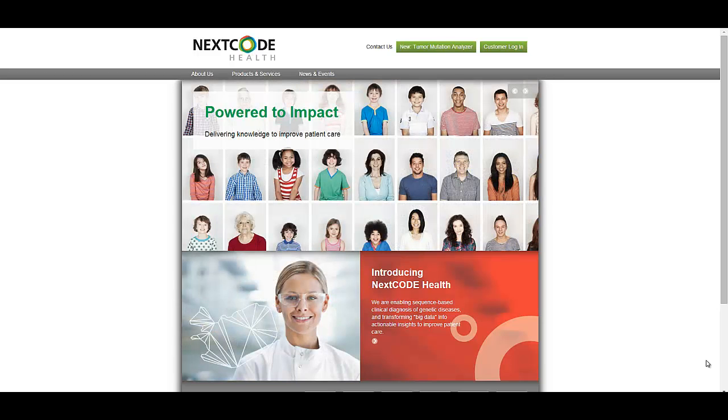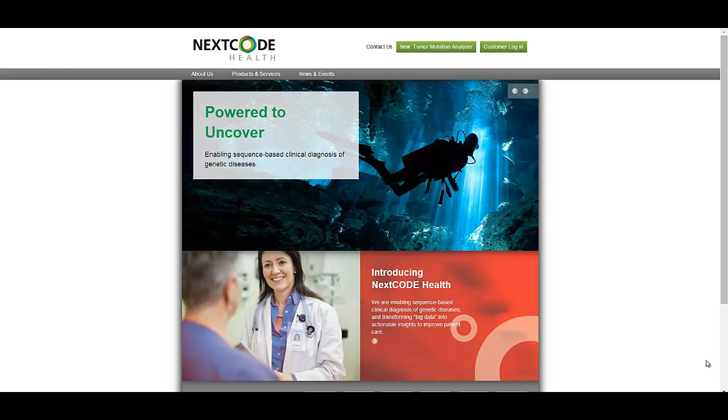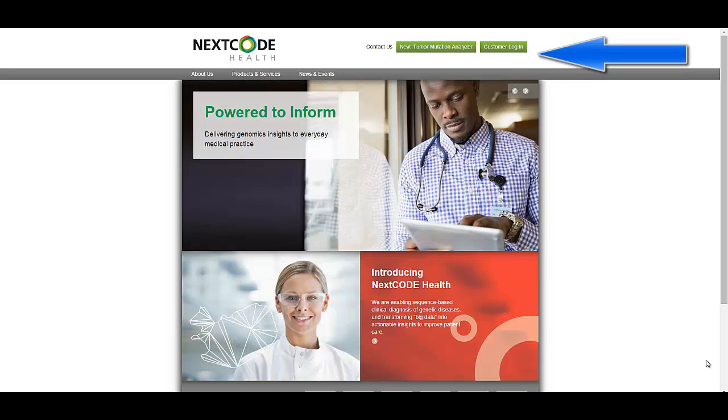This video is created to accompany access to the Genomics England Rare Disease Project and the Nextcode Health Clinical Sequence Analyzer. Its intent is to demonstrate how to reach the conclusions presented by Nextcode to the 2014 Genomics England Rare Disease Bake-Off. At the Nextcode Health website, please log on to the customer login using your email and password.